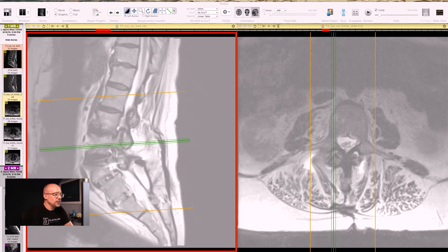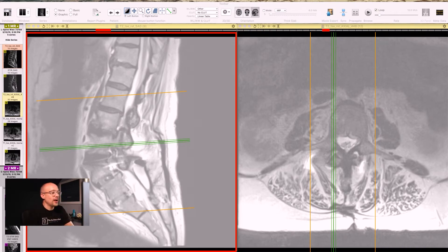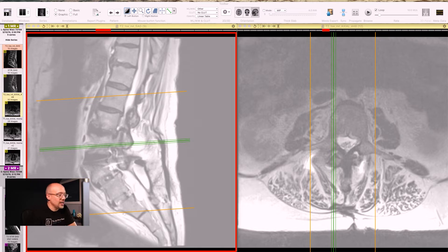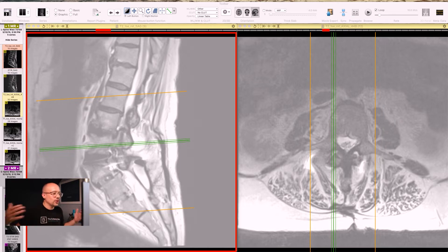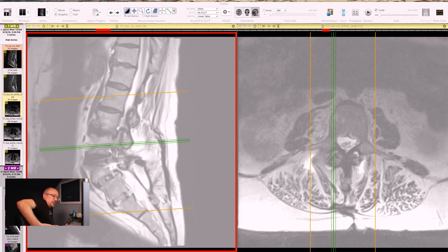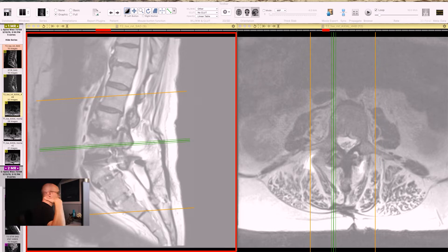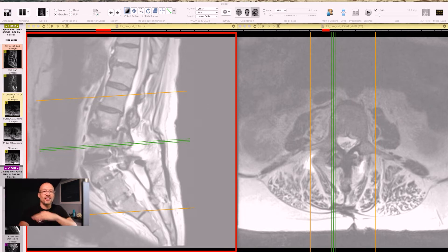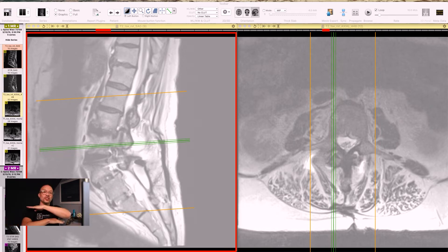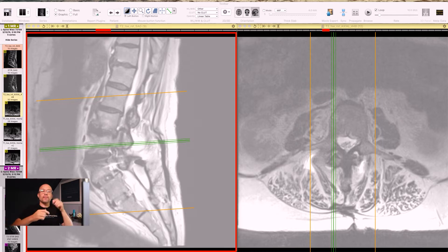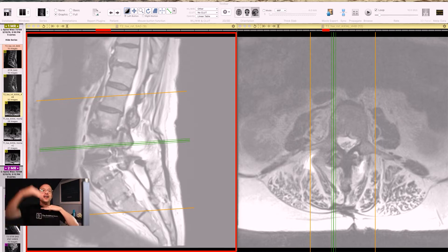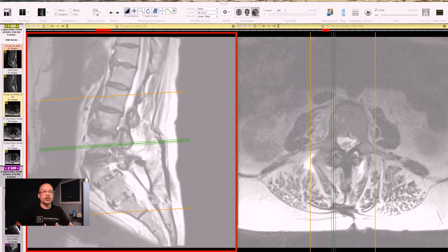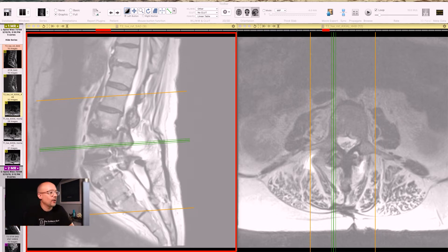So here we go with this patient. So this is a lumbar MRI image. On the left-hand side of the screen is the side view. That's what we call the sagittal view or lateral view. It's like you took a picture of me just as the camera's looking at me this way. That's your left-hand side of the screen. On the right-hand side of the screen is what we call the axial view. It's as if you took a slice like this and then looked up. The only difference, so it is a cut and look left and right are reversed because you're looking up instead of down. But that's what we have on the screen here.